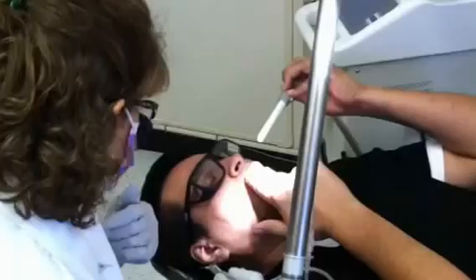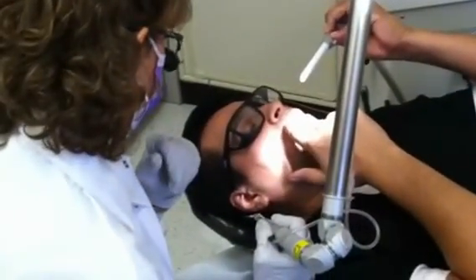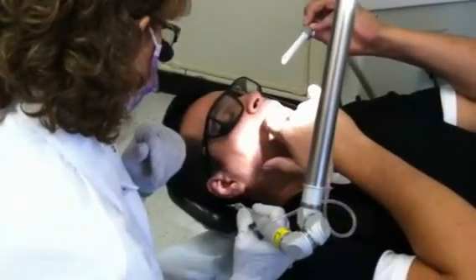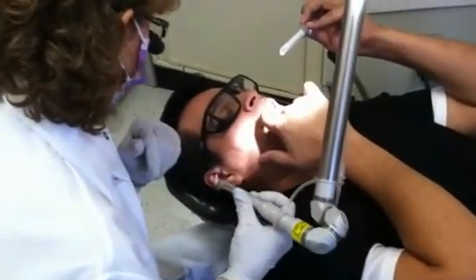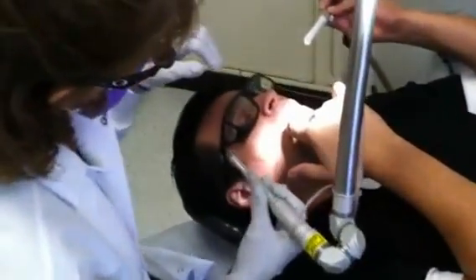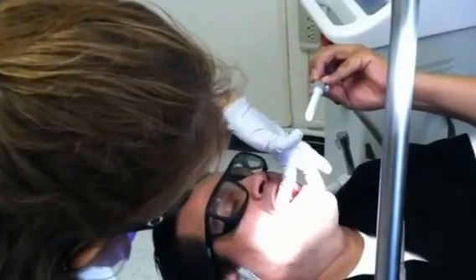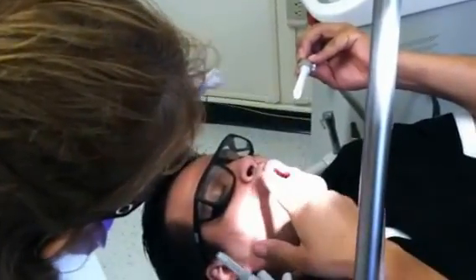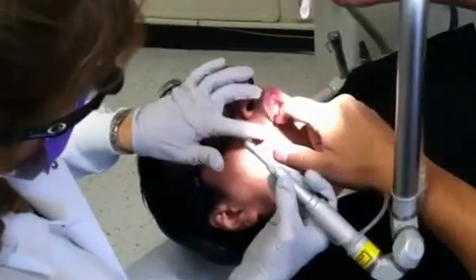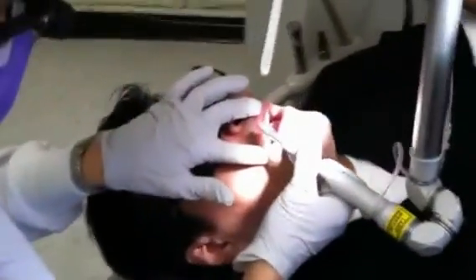Oh yeah. Can you tell the difference? Yes, I can. Can you feel any new blisters or areas that I haven't laid? Do you want me to do a little bit more? I'm going to do some tender spots, but I can't quite see yet — right in there? Yeah. How about on the inside here — is that tender on the inside? No. After that dried up really, really quick, I'm going to come in kind of on the side on this top one here.